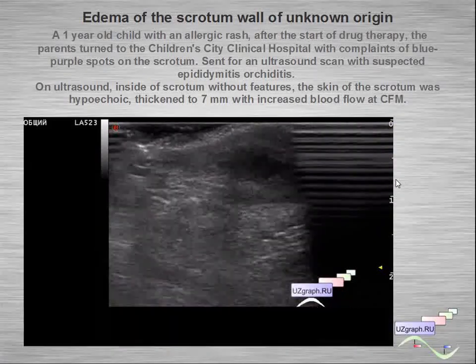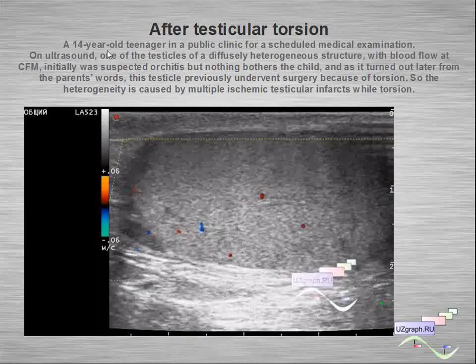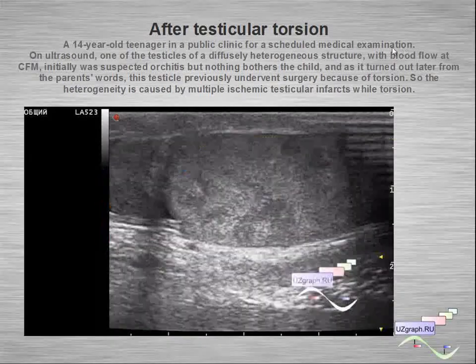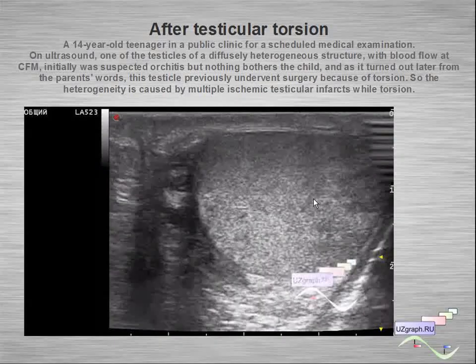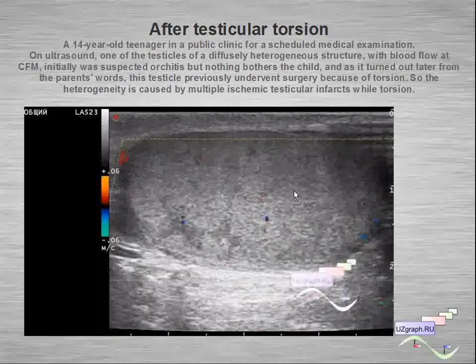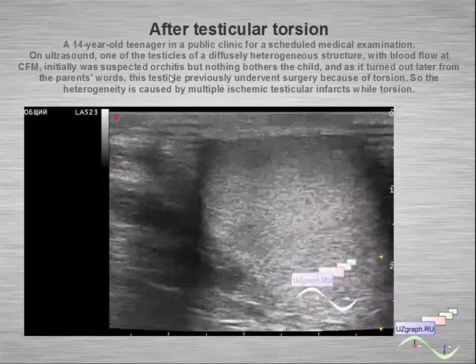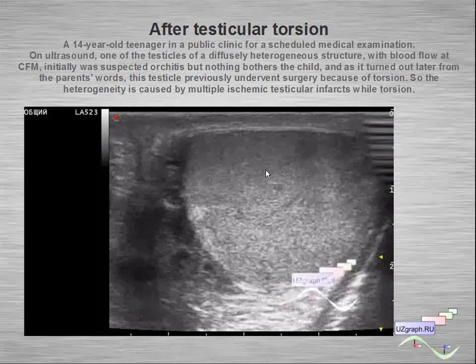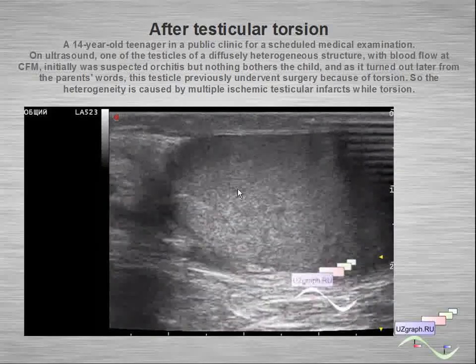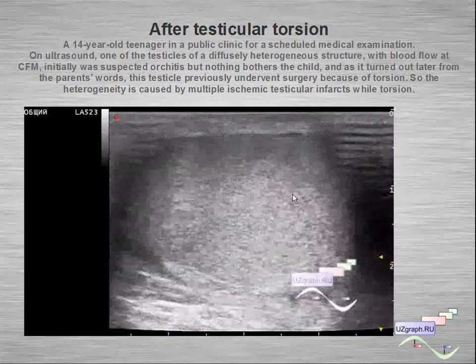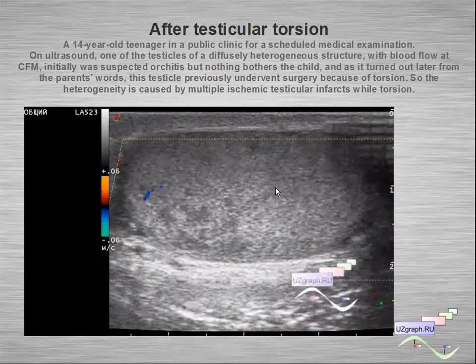This is a condition after testicular torsion. A teenager came to the clinic for a scheduled medical examination. On the initial scan I suspected orchido-epididymitis, but the patient had no pain and no complaints. I later obtained information that this case involved a prior torsion — so we can say this is an infarcted, necrotic area representing ischemic testicular changes after torsion.